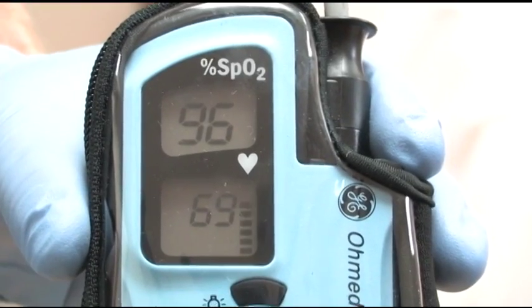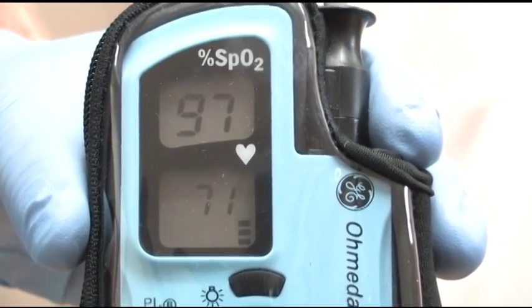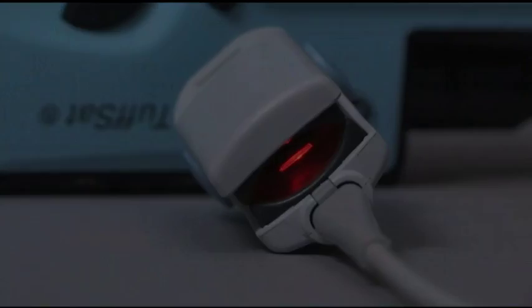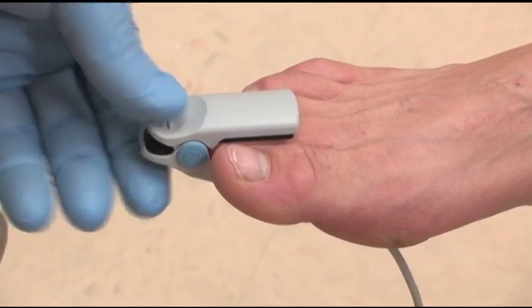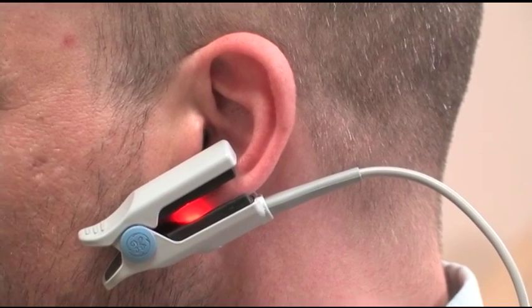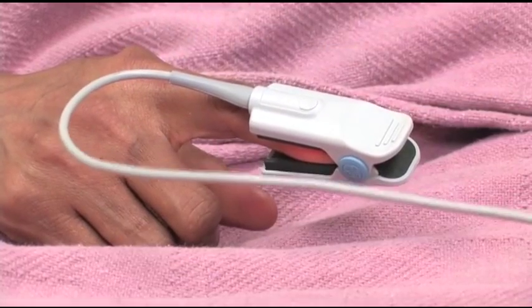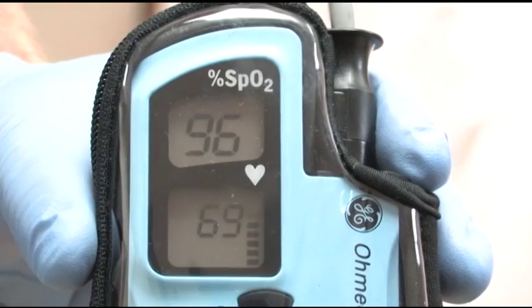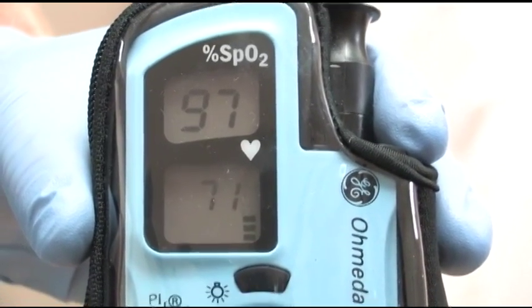A pulse oximeter is a photoelectric device that measures the level of oxygen circulating in a patient's blood vessels. It consists of a portable monitor and a sensing probe. An oximeter sensor is most commonly clipped onto a fingertip, toe, earlobe, or in the case of an infant, the distal foot. Once activated, the device sends different colors of light into the tissue and measures the amount of light that returns. It records the results as the oxygen saturation percentage, or SpO2.